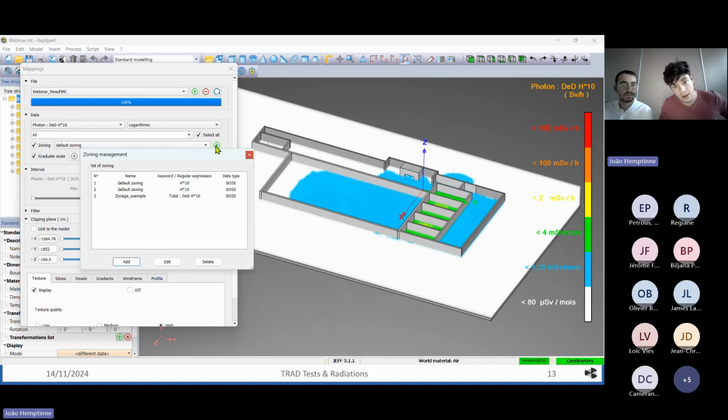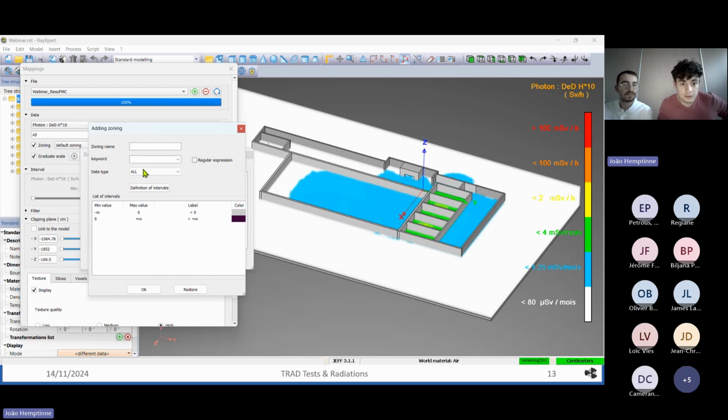So you just click here on the red button, add. Here we can name this English zoning. Keyword: generally, when we talk about zoning, the quantity that we want to estimate is the dose, the H*10, data type dose. And here you can set all the different values.